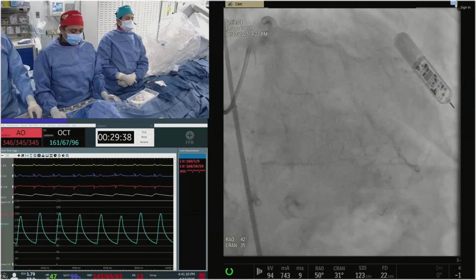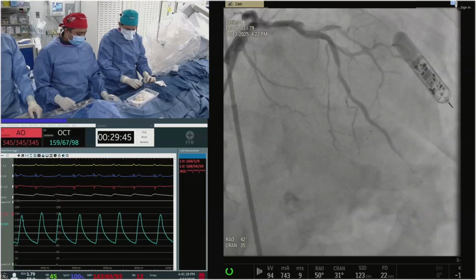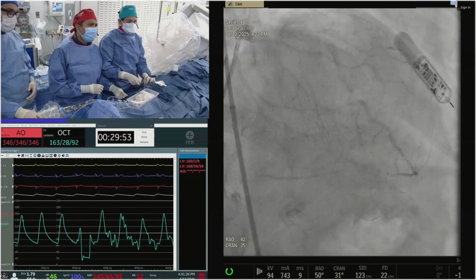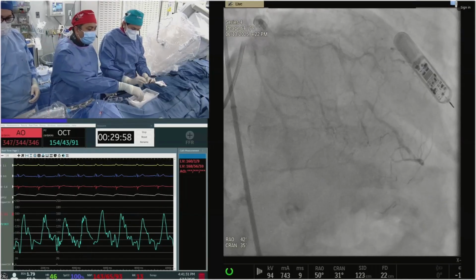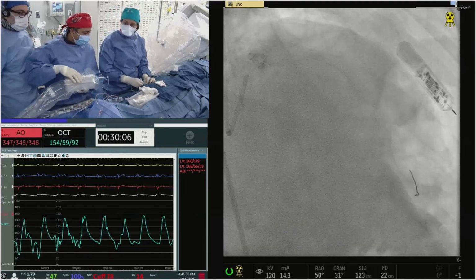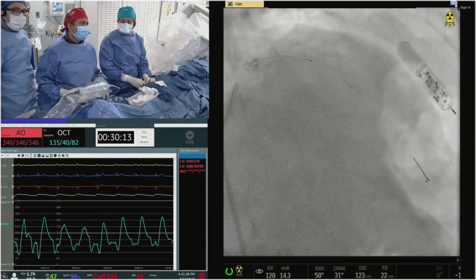So, significant disease, short, focal. The landing zone after the lesion, has that like a calcium nodule there or something? Yeah, that's what we also felt, that even on the angiography, we can confirm it with the OCT. The OCT, of course, will give us all the clues as to how to proceed, but I completely agree with your decision to leave the diagonal alone if possible.